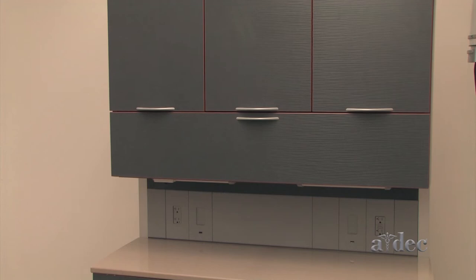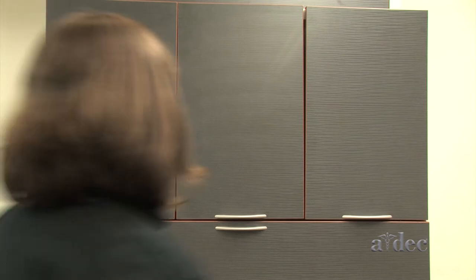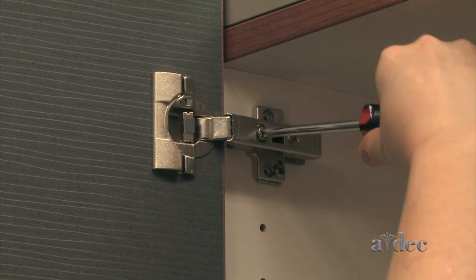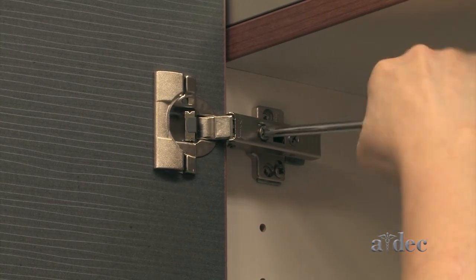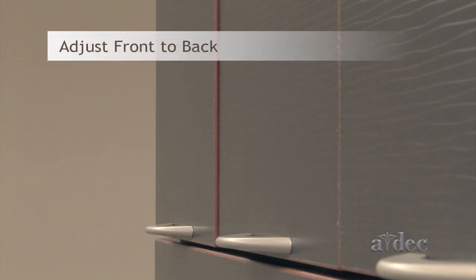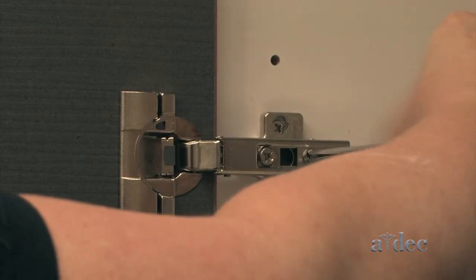To adjust the doors on A-dec Inspire, you may need to adjust both the top and bottom hinges. For a side to side door adjustment, turn the front hinge screw. To align the doors front to back, use the back hinge screw.